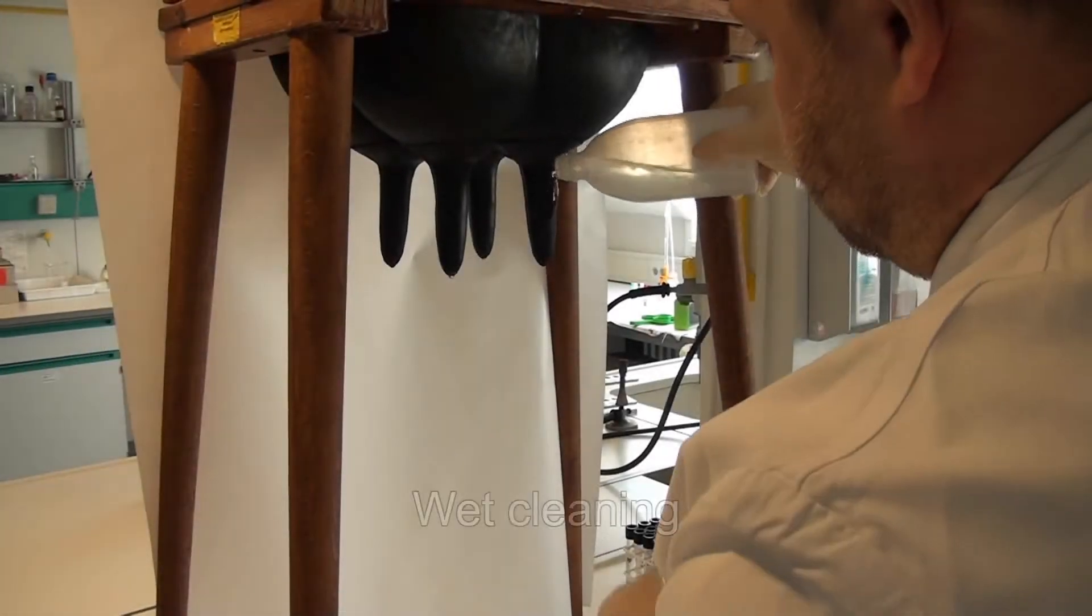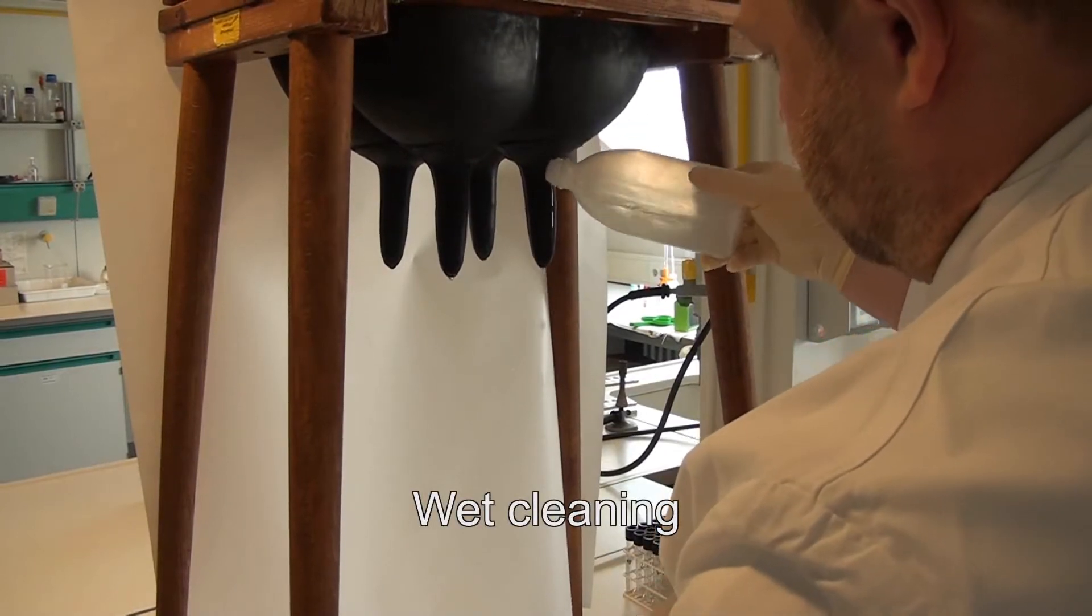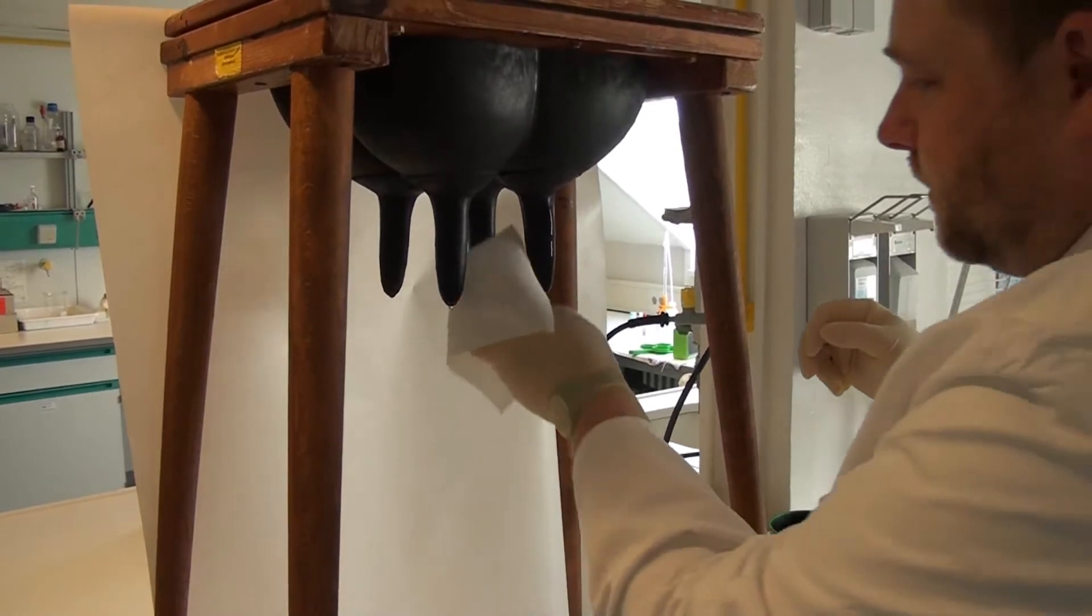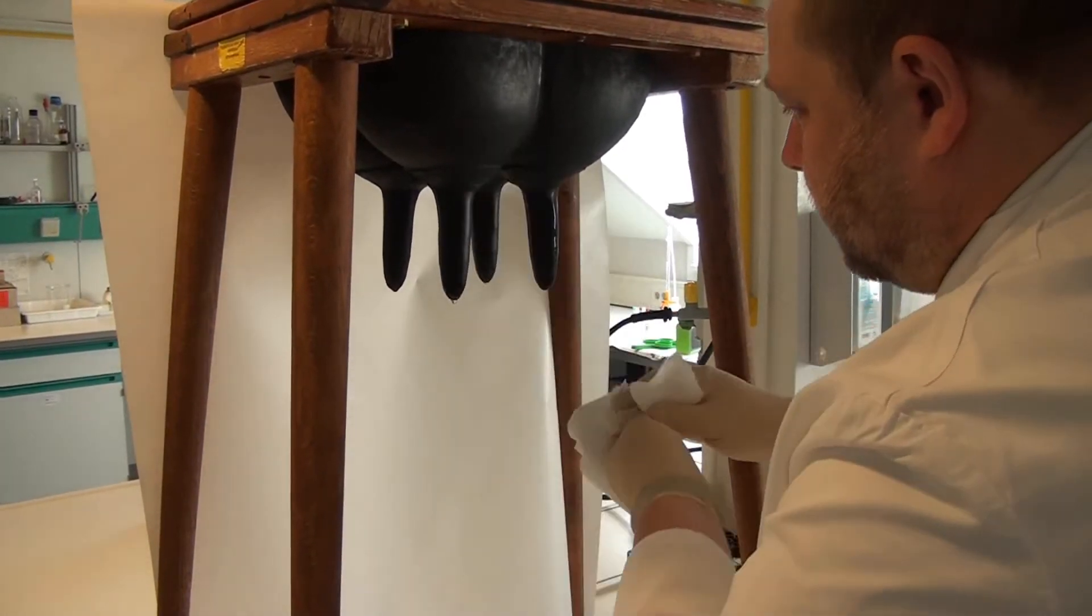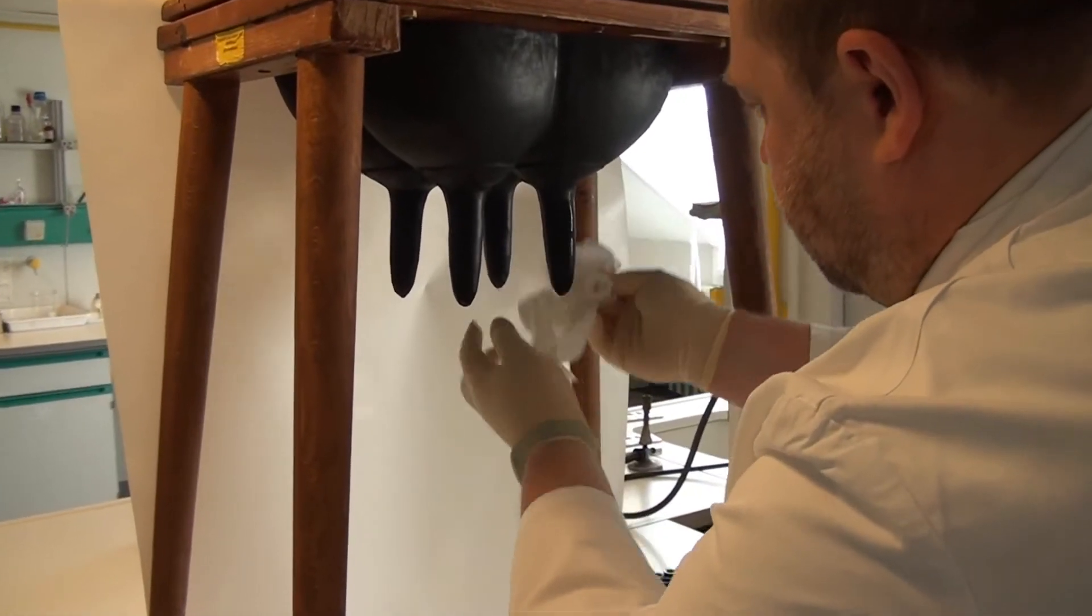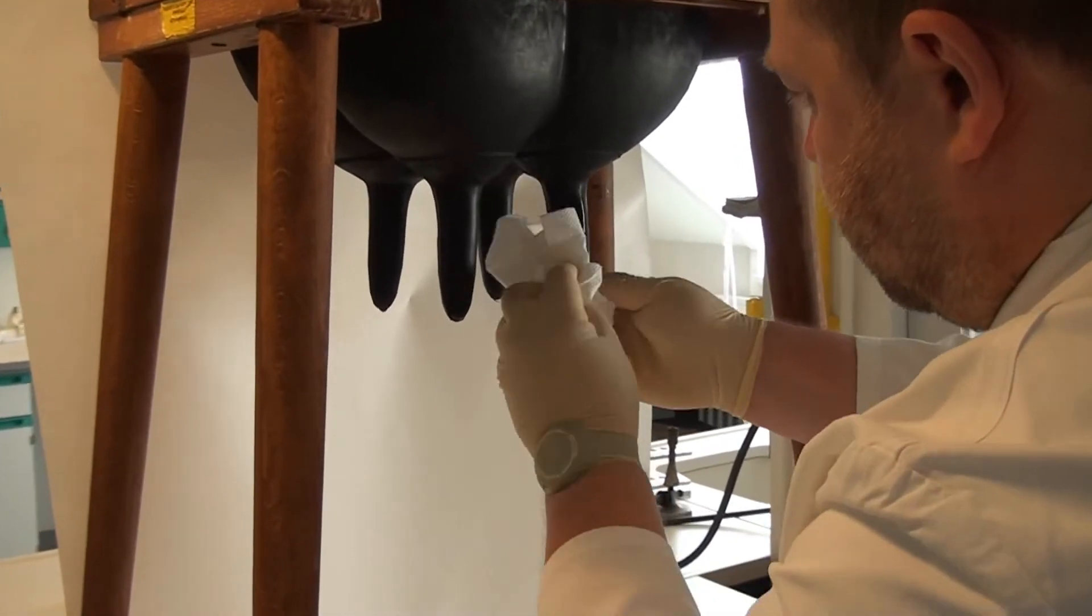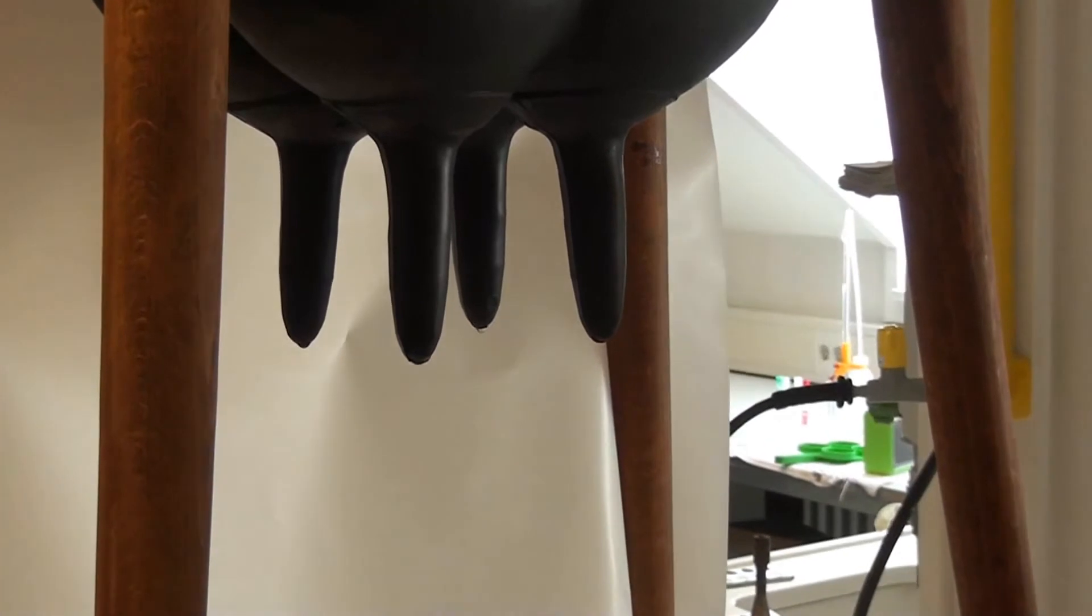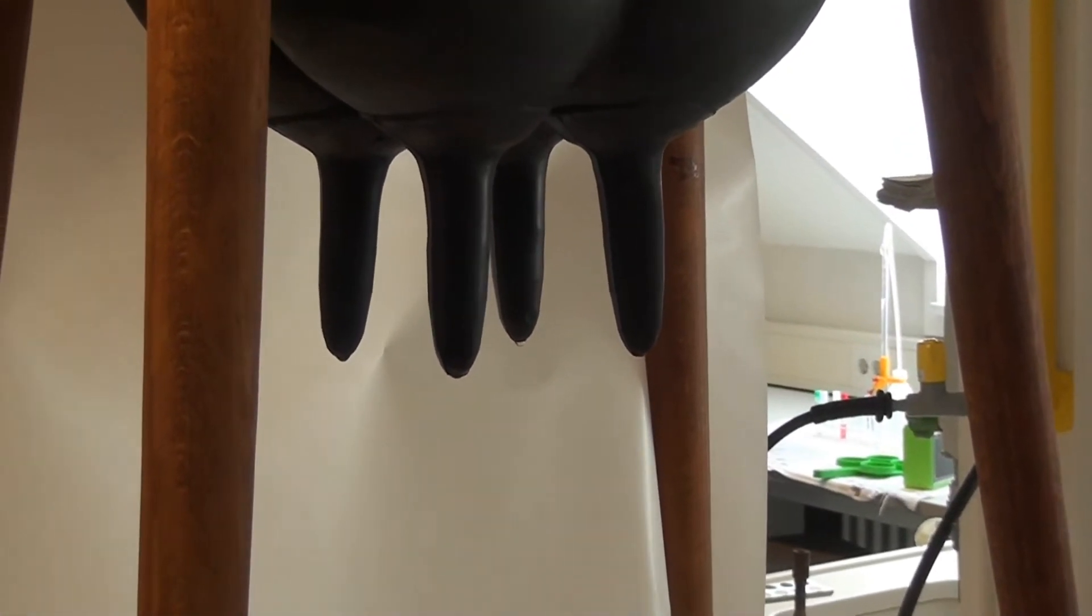By way of exception, when teats are heavily contaminated, they may be cleaned using warm water. In the parlor, there are usually hand shower sets for that purpose. The way the teats are dried should be stressed, from distal to proximal, in order to keep teat-tip contamination at a minimum.